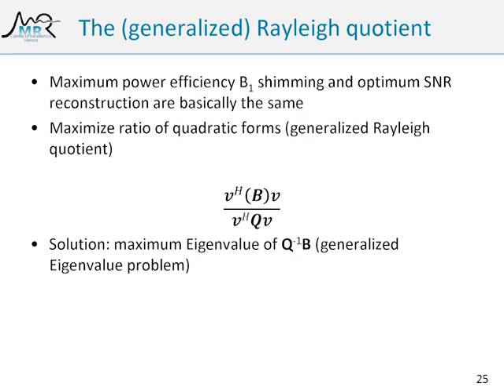Like this. So we've got a vector. So this is just the dot product between the scaling vector and the B1 vector, and we multiply it by itself, complex conjugated, and then what we get at that position is just the B1 squared that we get from the combination of all the B1 fields with the combination vector V.